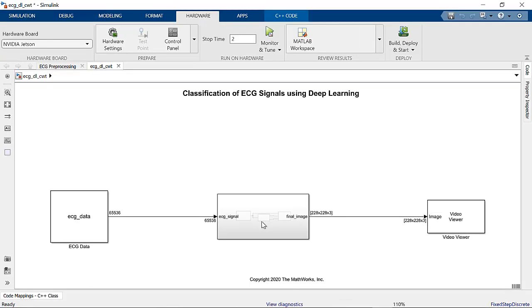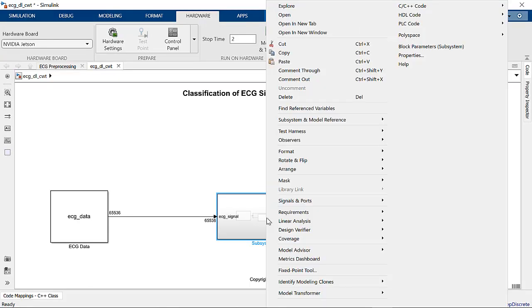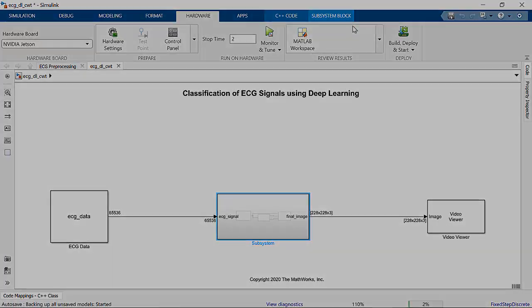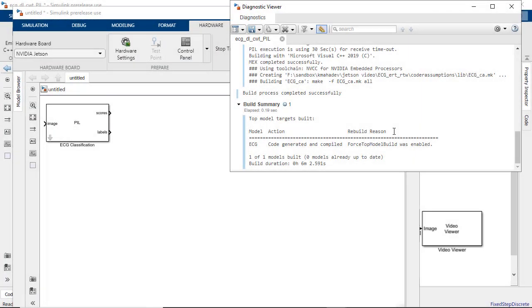With these settings configured, let's build and deploy to the Jetson board. We can see that the deployment process is successful and a PIL block is created.